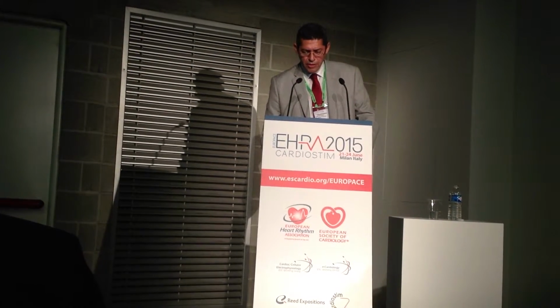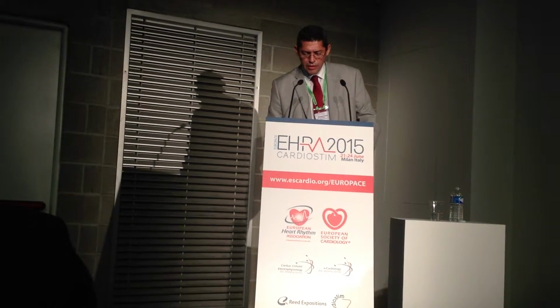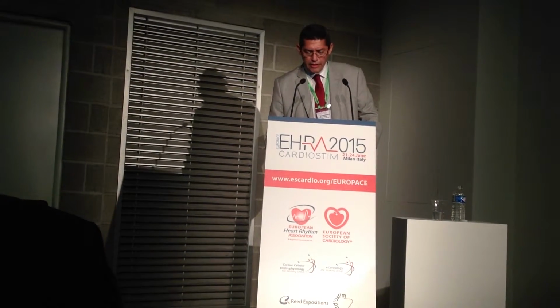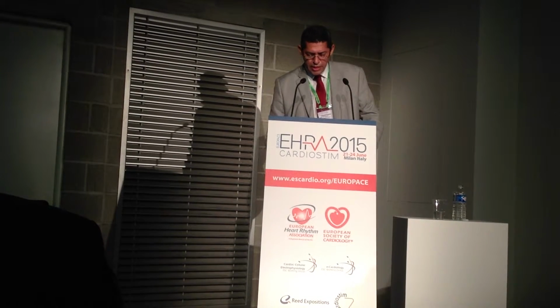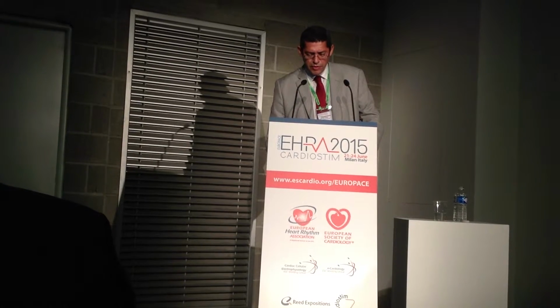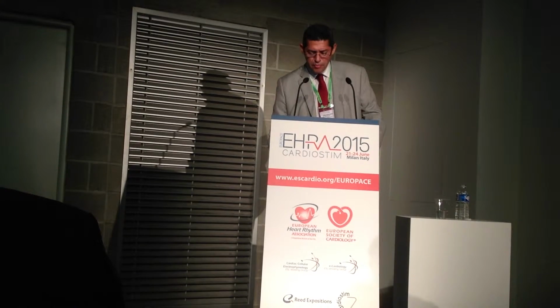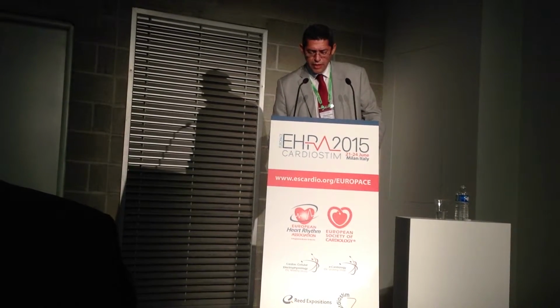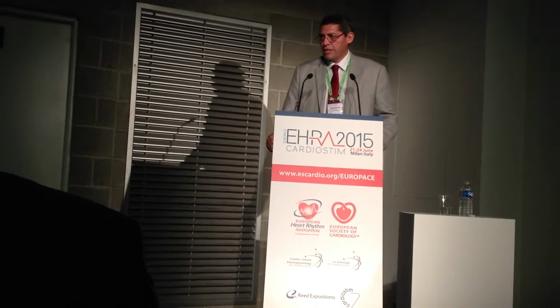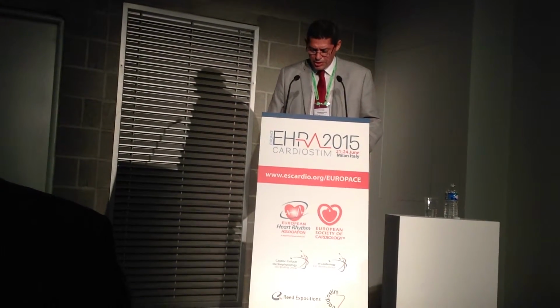In the frontal plane, you can see lead 1 becomes markedly negative from RVOT to mitral annulus, and lead 3 becomes more positive than lead 2. In the precordial leads, you can see late precordial transition in the RVOT with left bundle branch block, and here in the mitral annulus, early precordial transition with right bundle branch block. But a lot of indices have been described, but their analysis is not the objective of this presentation.